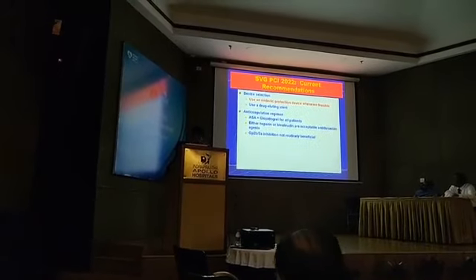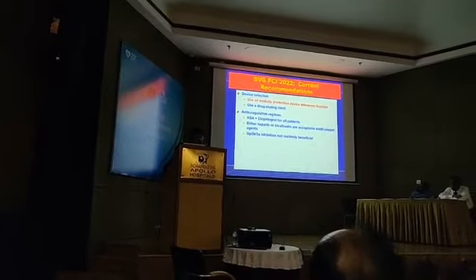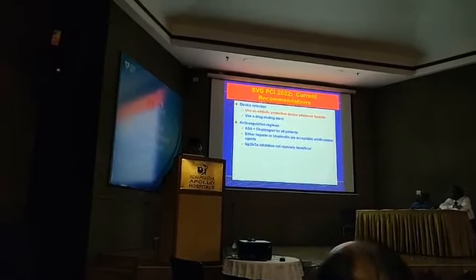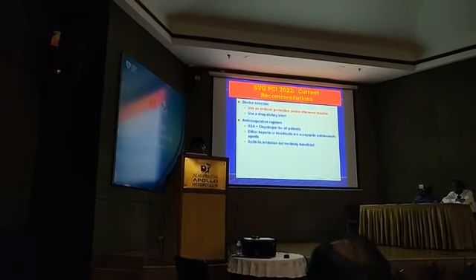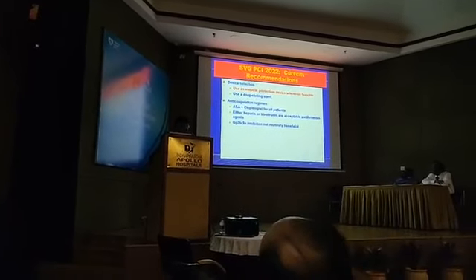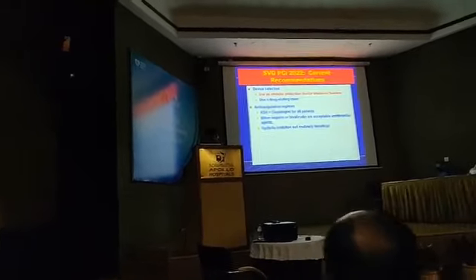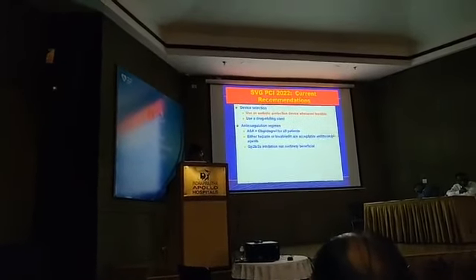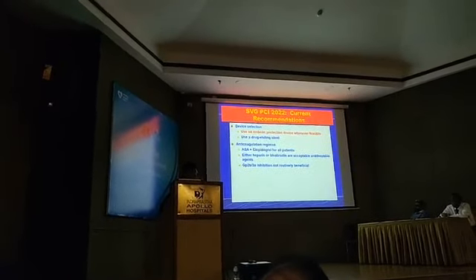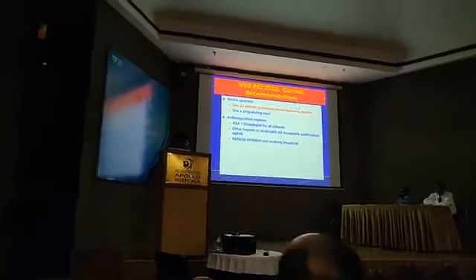Finally, just to conclude, in any case where you have a post-bypass angiography, you have to be very judicious. If you are able to do a native angioplasty of the area which is being supplied by a graft which is occluded, then do the native angioplasty. If not possible, because of total occlusion, you have to do saphenous vein graft angioplasty. You have to be very careful. If you have a degenerative graft with thrombus, you have to use a protection device to have an optimal result with TIMI 3 flow, otherwise you may end up in problems. So saphenous vein graft angioplasty is more of a challenge, and post-bypass cases are at least 7% to 10% of our routine contemporary practice. Thank you very much.